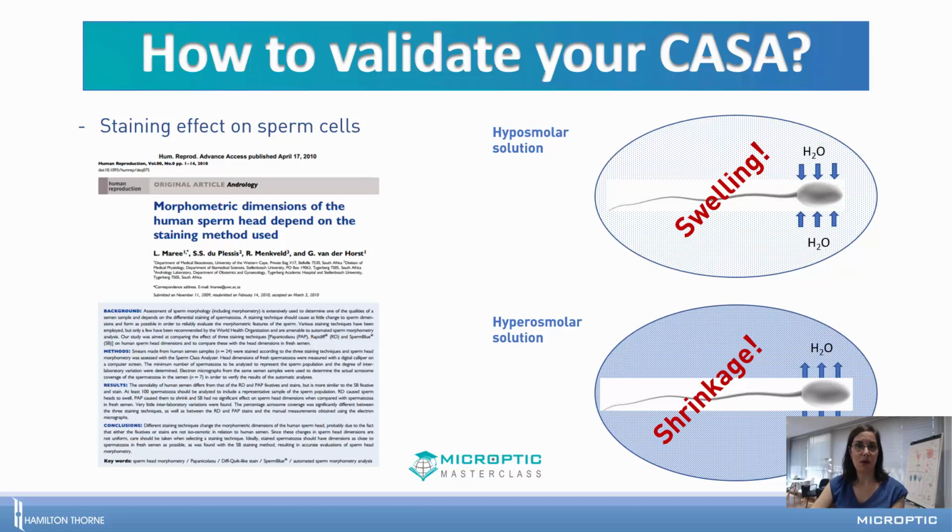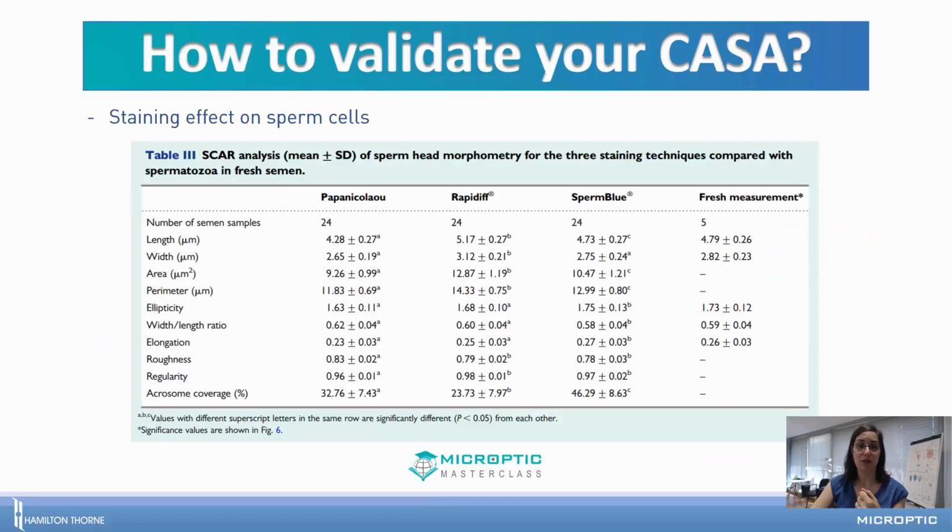This is important. Why? Because you can get different diagnoses depending on the coloration you are using, and it's important to standardize. What are your standards? What is the coloration to be used for your routine and obviously for your validation?